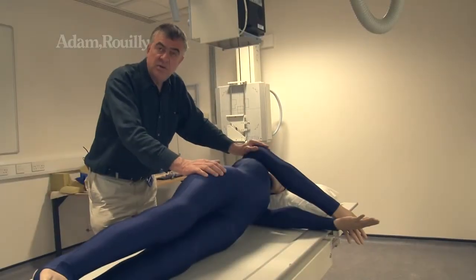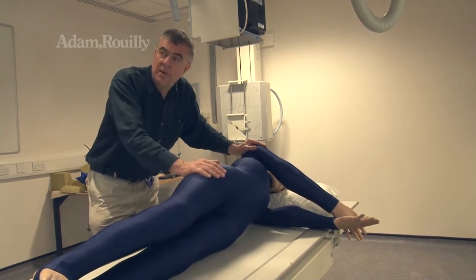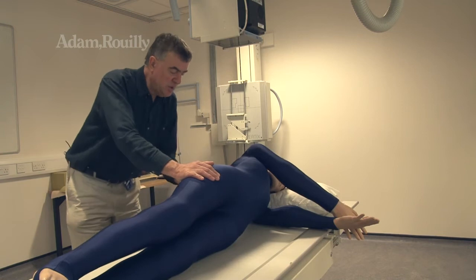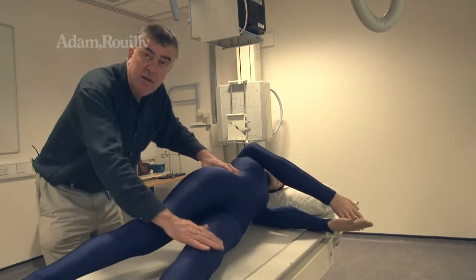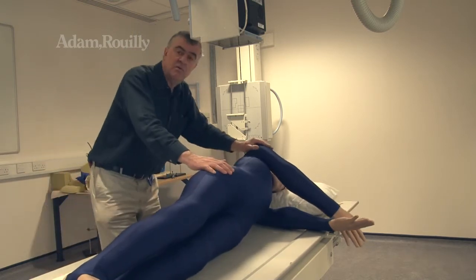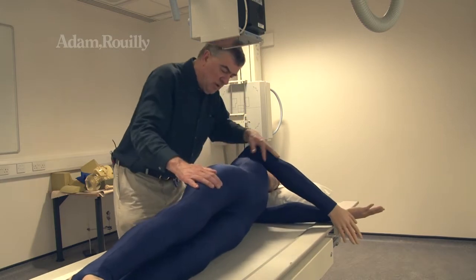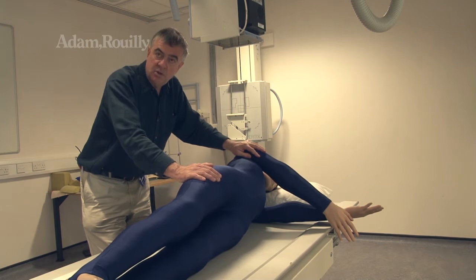But the issue of course with patients is that we're three-dimensional, so when we take images we have to take them in two dimensions. So as before we were taking images from the front, we can also do it with the patient lying on their side. For example, we might do a spinal X-ray here, or we can also use this position to do images of the knee, as would be done with a real patient. So the doll is very, very versatile and useful for that. The hands can quite easily support themselves up there, and this is very lifelike and is very good for practice purposes to teach good technique.